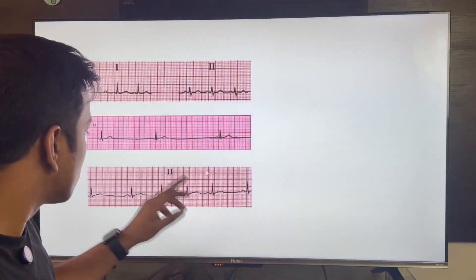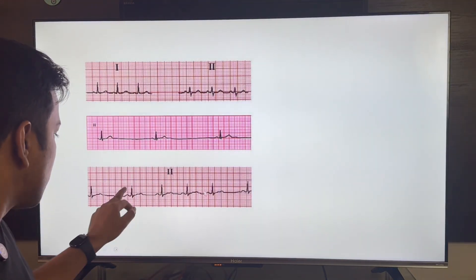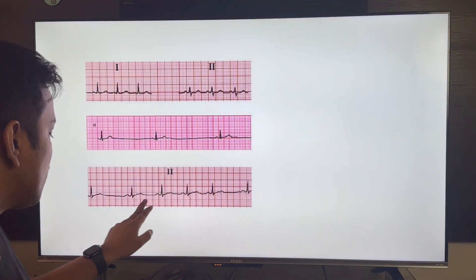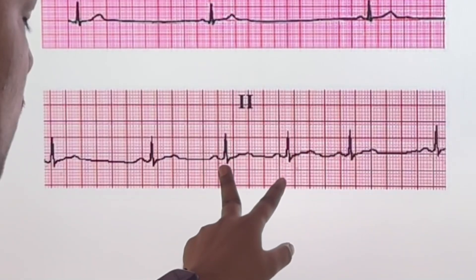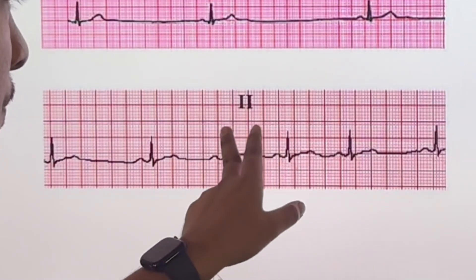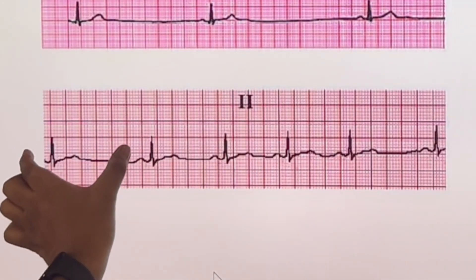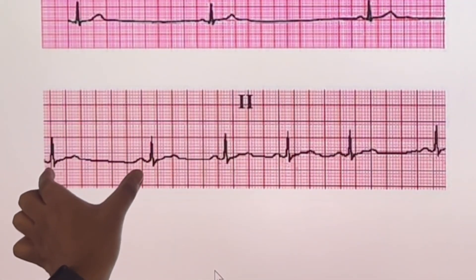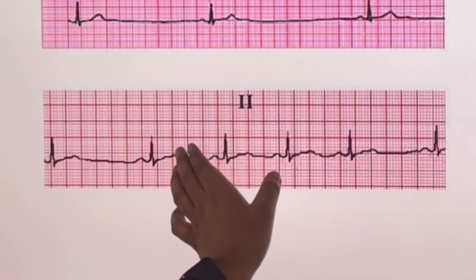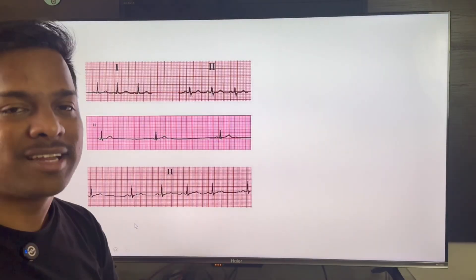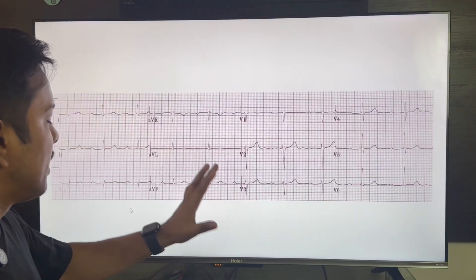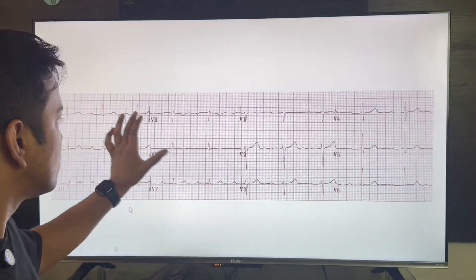In the third ECG, we can see that at some points there is crowding of the QRS complexes, and at other points there is no crowding. This has to be sinus arrhythmia.